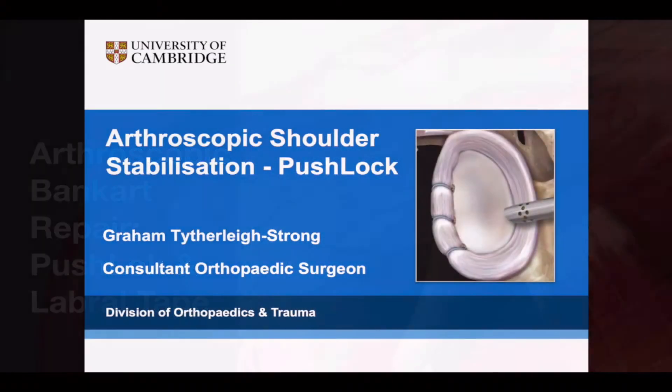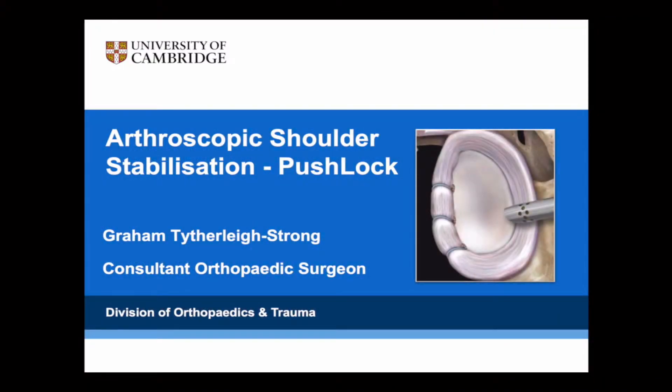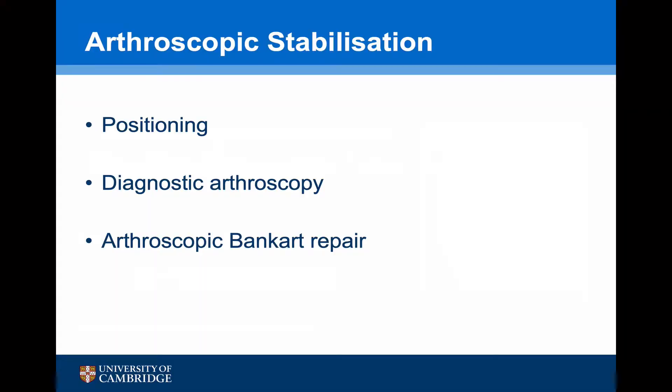This is an instructional video on how to undertake an arthroscopic Bankart repair using the push lock and labral tape system. The key steps to undertake a successful arthroscopic stabilisation are positioning of the patient, undertaking a diagnostic arthroscopy, and then an arthroscopic Bankart repair.